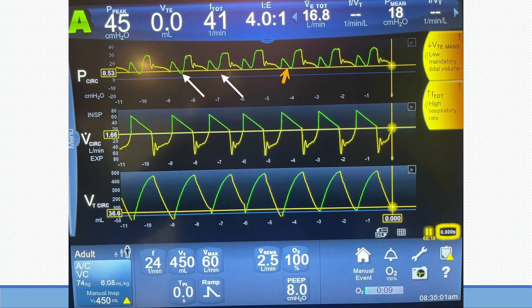This pattern is happening almost every single breath, as you can see here. This indicates the patient has air hunger. But what is the respiratory drive of the patient, and how can we measure it?